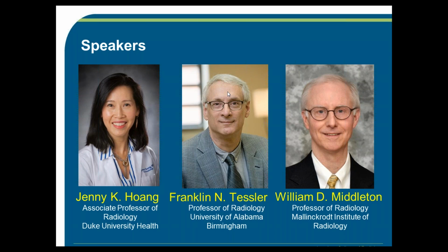Dr. Bill Middleton is a professor of radiology at Mallinckrodt Institute of Radiology. He is a national leader in thyroid ultrasound as well. Bill was a key member of the ACR TI-RADS committee. In particular, he had available a multi-center study with the Society of Radiologists in Ultrasound, and it's through his work with that society that we got a database of more than 3,400 nodules, which allowed us to test our preliminary models and really make ACR TI-RADS evidence-based.